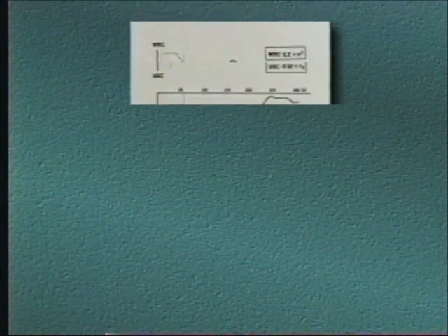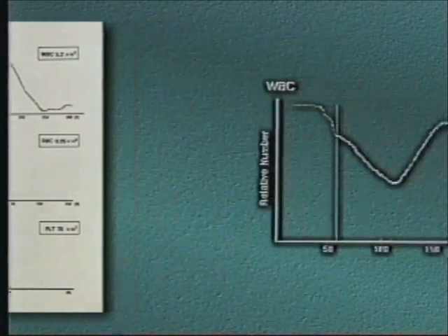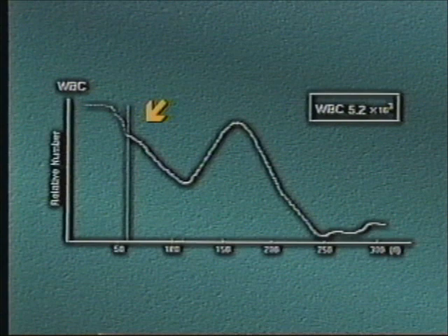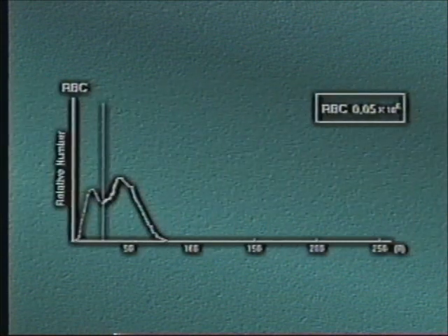This histogram from the same 3-part analyzer shows an unacceptable WBC histogram. There is interference which causes what we call a high takeoff. The histogram does not begin at baseline. This would not be an acceptable count on peripheral blood, so it is not acceptable on a fluid. The right side of the curve also shows an abnormality. The curve does not return to baseline but rises. This is often an indication of very large cells or clusters of cells frequently associated with a malignancy. Remember the monstrous and ball-like clusters of malignant cells?